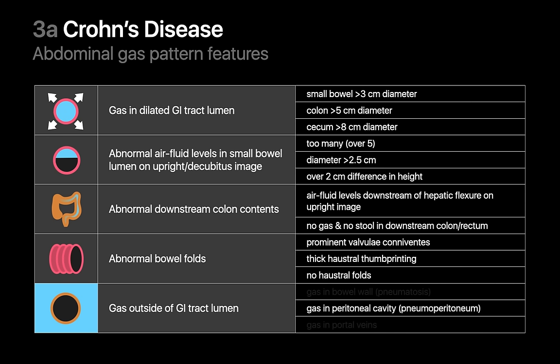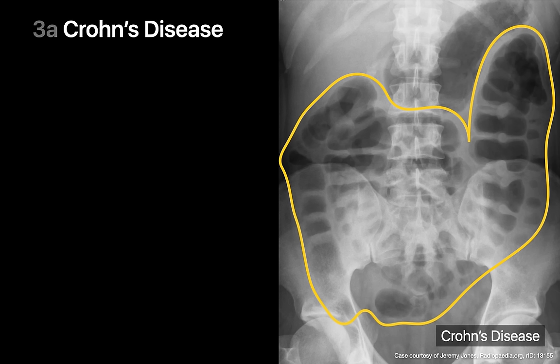Bowel perforation is a known complication of Crohn's disease, which can result in free gas in the peritoneal cavity. In effect, almost every single finding on the table may potentially present in an x-ray of a patient with Crohn's disease. In this example of Crohn's disease with colonic involvement, we can observe that the haustral folds of the colon are thickened and that a couple of dilated air-filled small bowel loops are also present in the mid-abdomen.